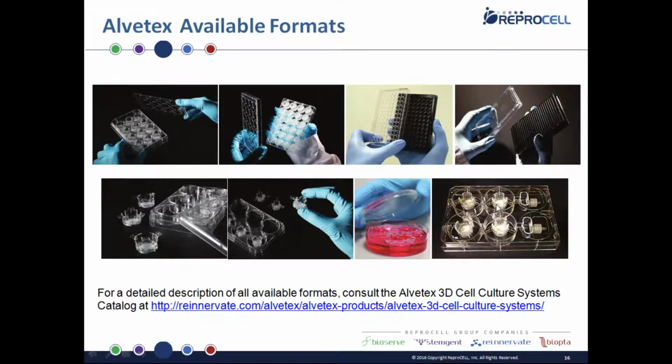It can also be useful for model of infection, where if you imagine you had a culture that was infected here, and you could just record how quickly the infection is going to travel through the system. So that's just an example of applications.